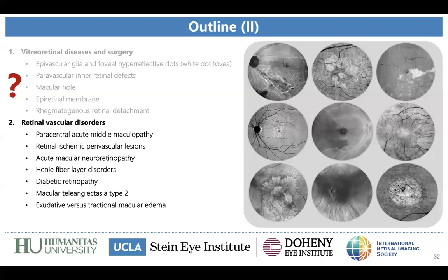I don't know if you have worked on that, but I've seen before in a conference, I don't remember who presented, the en face follow-up of a macular hole, because sometimes we see the macular hole closing, but then in a second time, you see the outer retina closing afterwards, right? So you can follow the closure of the outer retina through en face, even though the macular hole is already closed by the OCT. Have you done something about it?